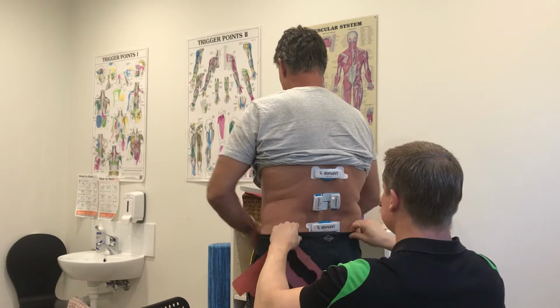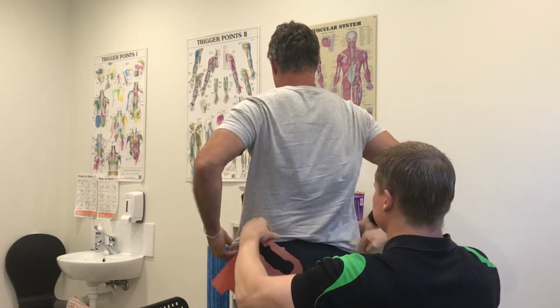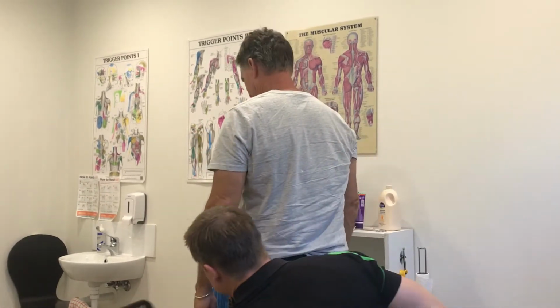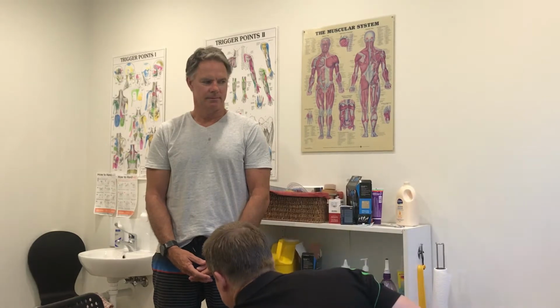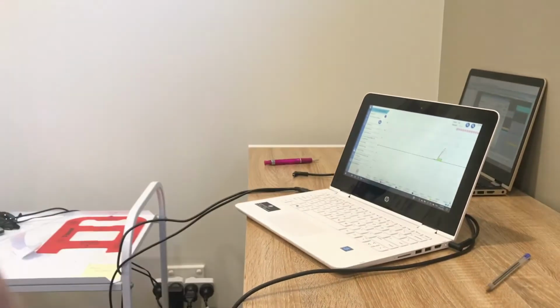Sometimes the first move you do, they feel like they're going to come off really very good. Now, first thing I want you to do is nothing. So just stand there in a nice straight position. Just going to monitor the curvature of your lower back. Now, every time you move, if you bend forward, you'll see corresponding movement on this graph. So there's all the little monitors.